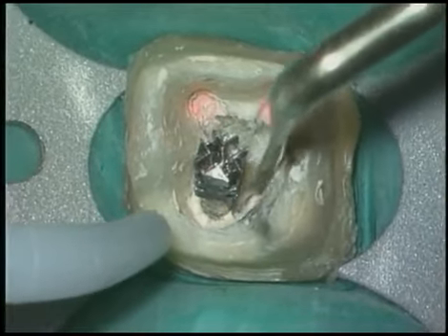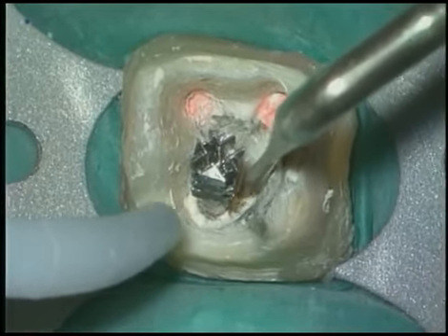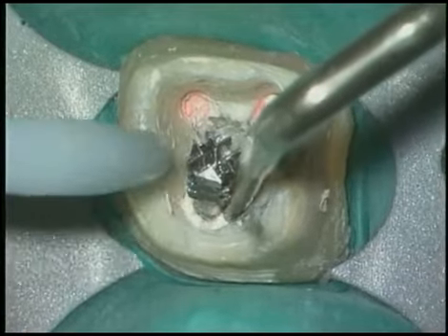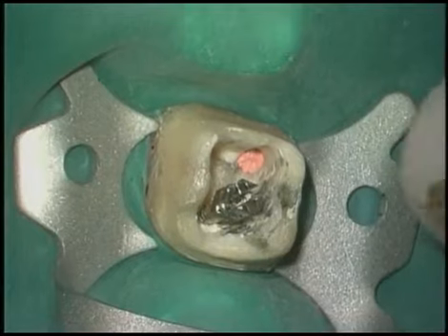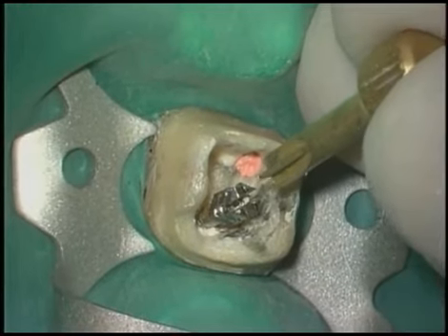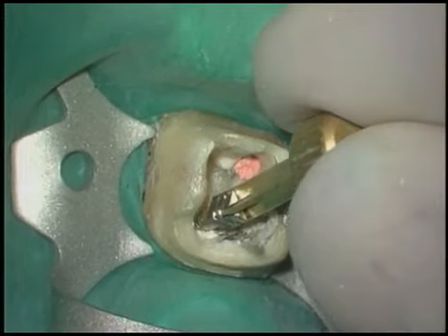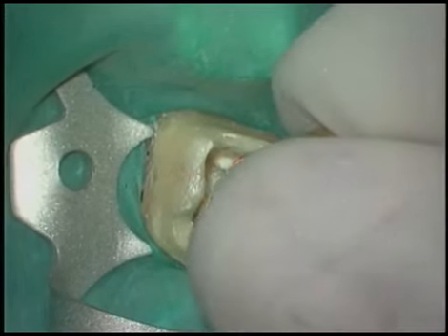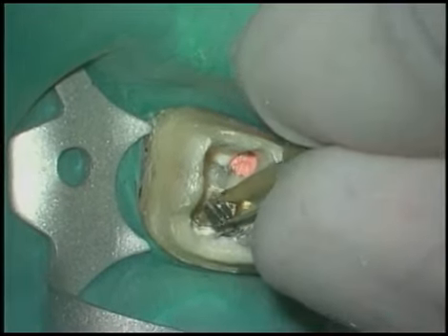We can even remove cements at the orifice level or slightly below, which will encourage subsequent removal procedures. These instruments are used very, very lightly, and it's surprising how much cement can be blown out. Most post systems, like threaded post systems, have engaging tools, and we can use an engaging tool to try the simplest way to encourage removal.